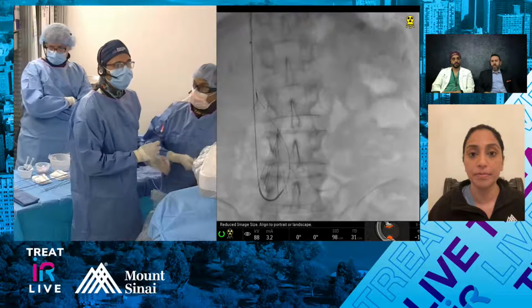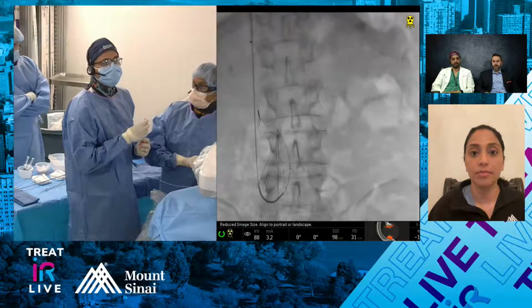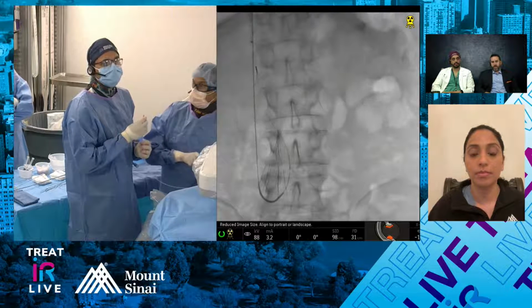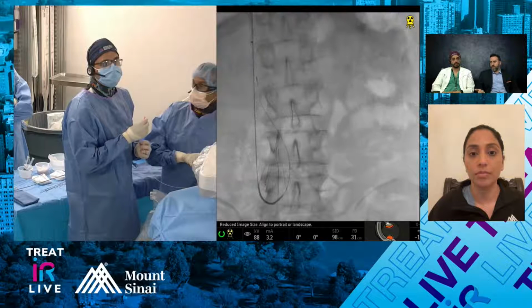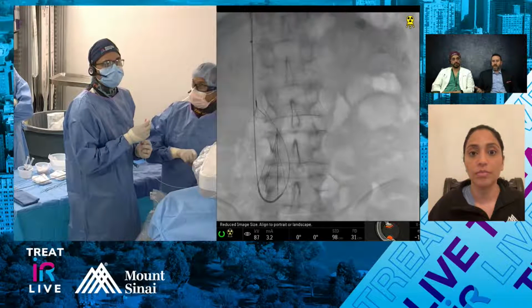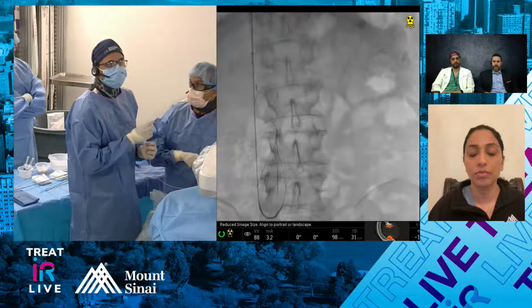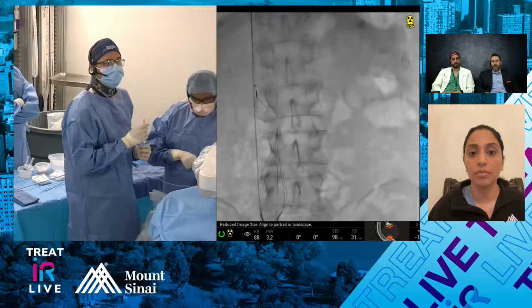Yeah, I'm the same way. I have a pretty low threshold to get a CT. I think more and more, medicine in general is going towards getting a lot more axial imaging in terms of pre-op for these things. For filter retrieval, obviously the clinic visit is really critical. If somebody's coming in, as soon as I stop my AC with the filter, I had really bad leg swelling, that's something you'd really want to investigate further. So just getting a CT venogram can save you a lot of trouble.